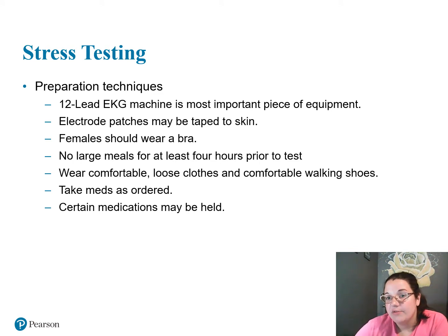So, how do we prepare for a stress test? We need a 12-lead EKG machine, which is the most important piece of equipment. Electrode patches may be taped to the skin. Think about it: had we done this in class, you would have seen how easily these electrodes can fall off. Imagine somebody moving with the electrodes on them falling off. We can tape them to their skin.